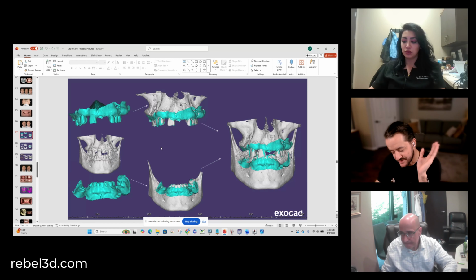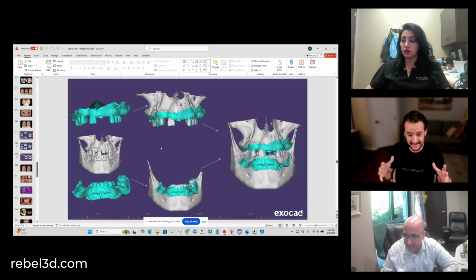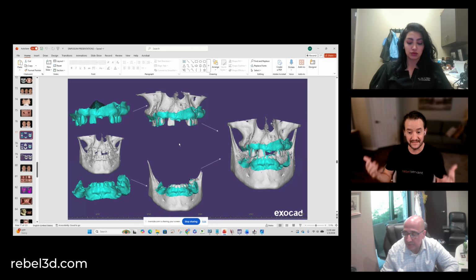And this is so good. I mean, you are thinking through the lens of what digital needs to be successful and the behavior of an iOS scanner and how that technology works versus the behavior of a CBCT scanner and how that technology works, right? I mean, this is important for a doctor to know about these attributes of the technology that you're using because there are limitations in behaviors of the technology and how it impacts your records.